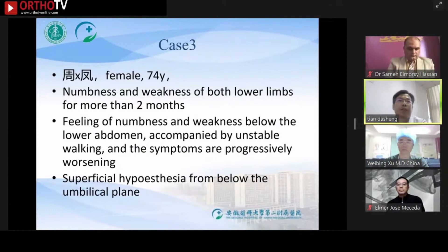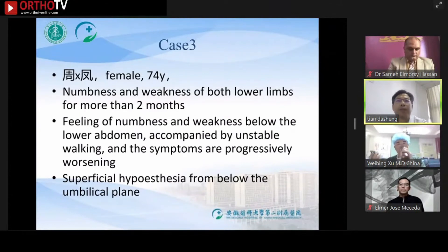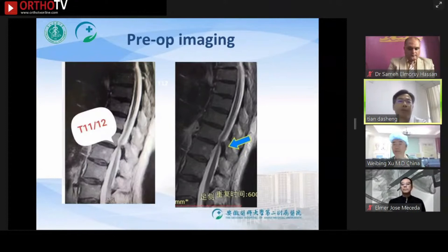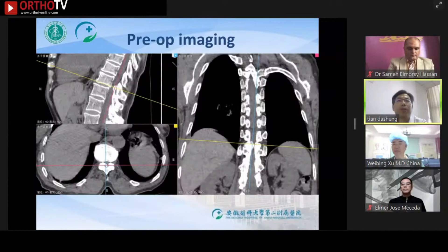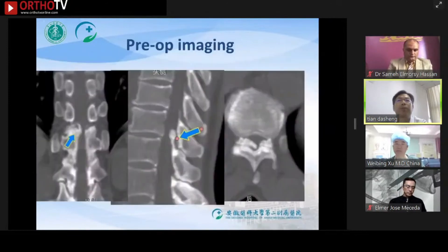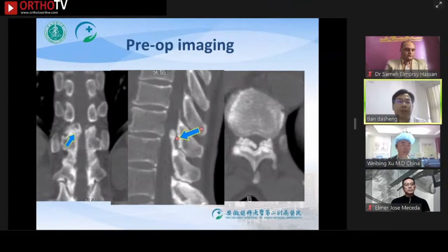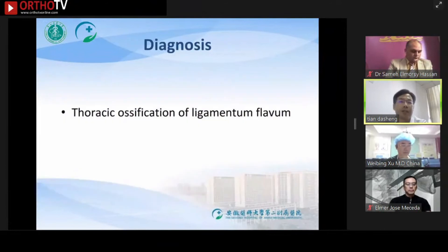Case 3: the patient is a 74-year-old female with numbness and weakness of both lower limbs for more than two months. T2-weighted MRI showed compression at the segment of T11 to T12. The CT scan suggests the compression is ossified ligamentum flavum. The CT scan shows there is compression on both sides, and from the cross-section we can see the compression on the right is more serious. The diagnosis is ossification of ligamentum flavum.